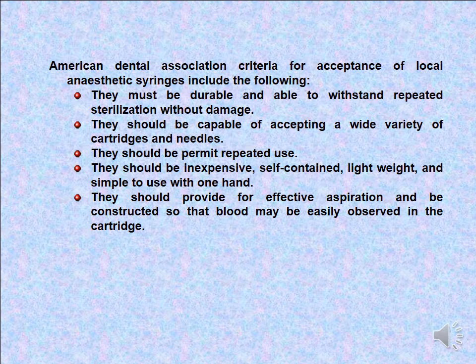They should provide for effective aspiration and be constructed so that blood may be easily observed in the cartridge. So we have windows within the syringe through which we can see any fluid, such as blood, pus, saliva or other fluid from within the body, when aspirating.